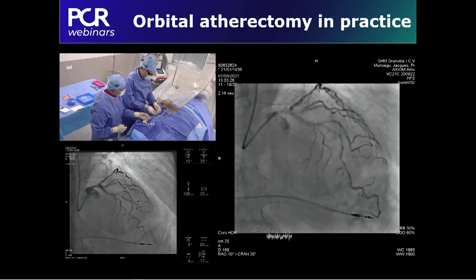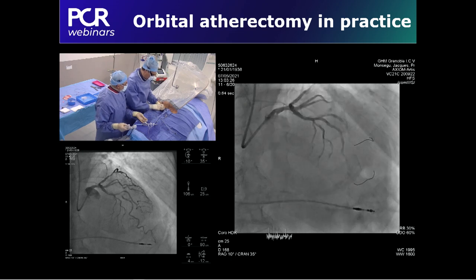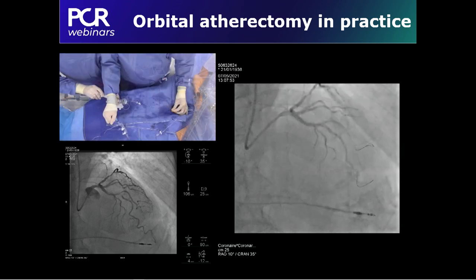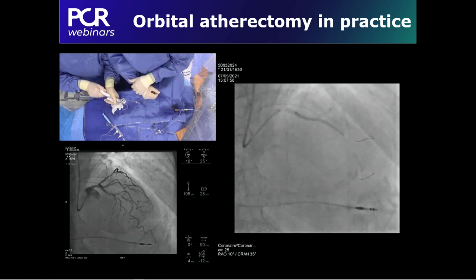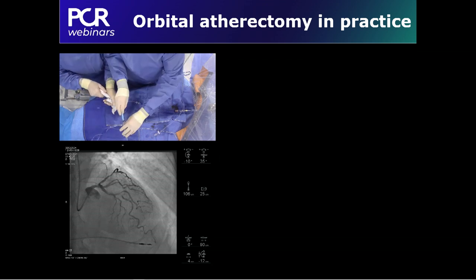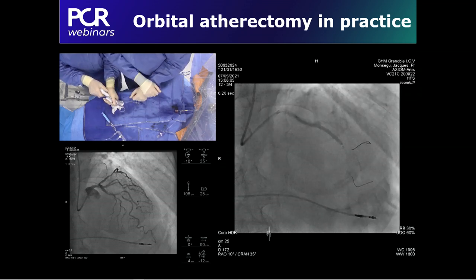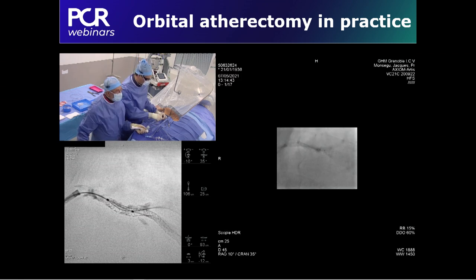Excellent. So we have decided to implant a long stent, 40 millimeter, 2.5 millimeter diameter, according to the distal landing zone. Okay, perfect. Slow inflation always. 10, 12 atmospheres. So no waste on the distal part. Yeah. And we're going to do a POT with an NC balloon. So back to finalize this post-dilatation with a 3.5 NC balloon, high atmosphere, 20 atmospheres.